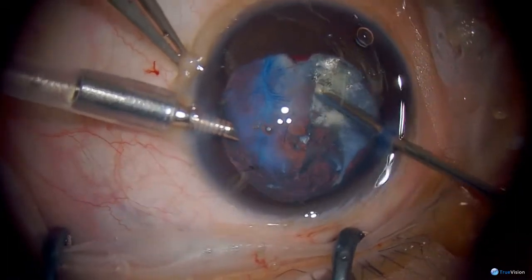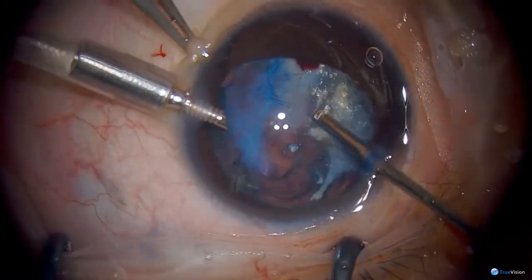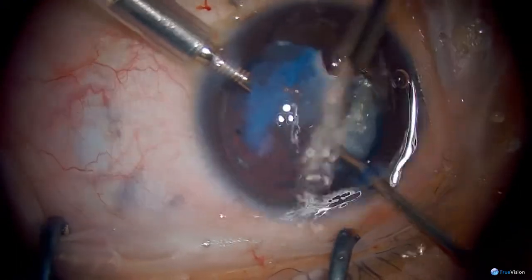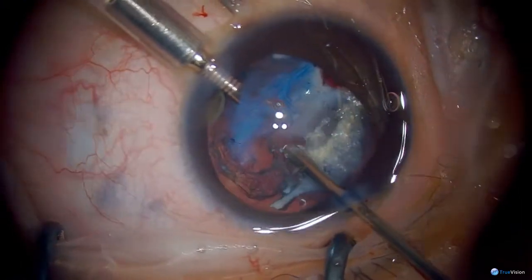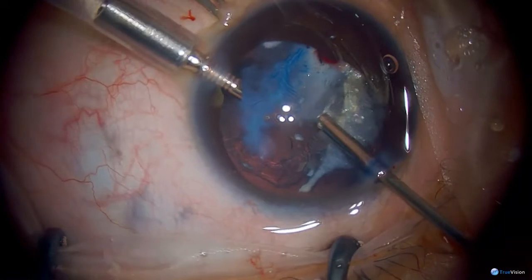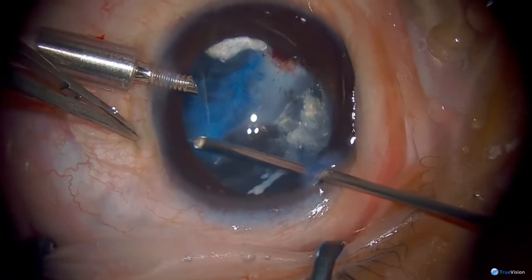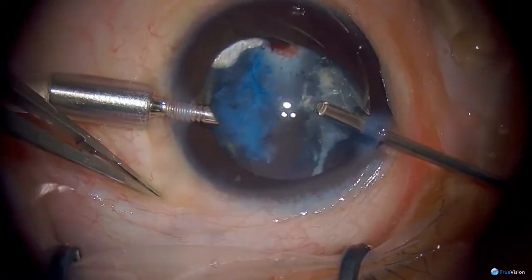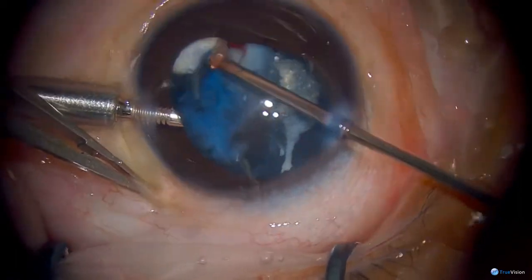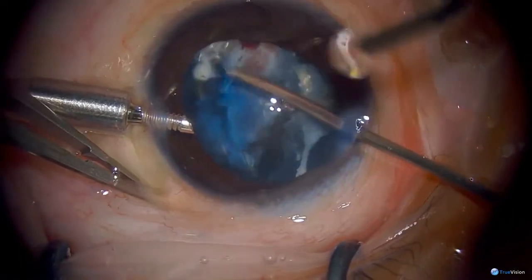Now we are going to put the lens in the sulcus, but the reason for removing all of this cortical material is that it can come out of the bag later and prolapse into the visual axis. So as much as possible, it's better to remove it now. I'm trying not to cut any of this material away. I'd like to aspirate it, because we're going to open up the posterior capsule. We can place the lens before or after a vitrectomy. It might be easier to do it before the vitrectomy.